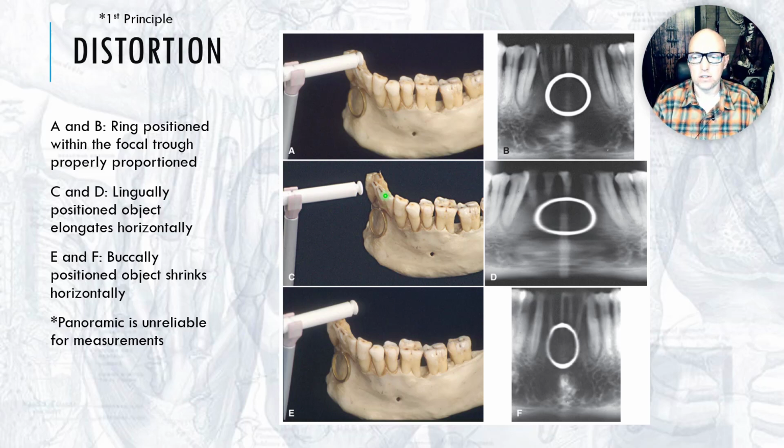If I move it back, think of that GIF I just showed you, something closer to the point source, the source of light, is going to be magnified. Being exaggerated in the horizontal dimension, it creates an oval appearance. It's really just stretched out, but it's magnified more in the horizontal direction.